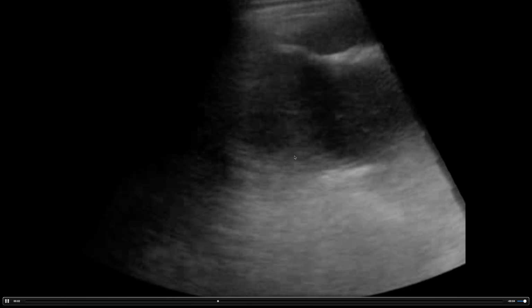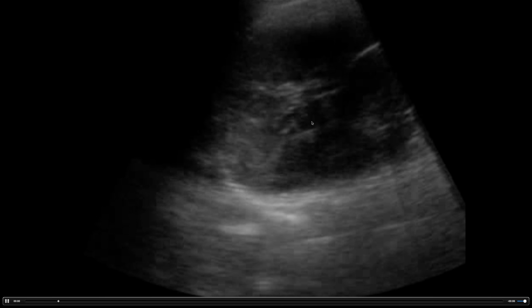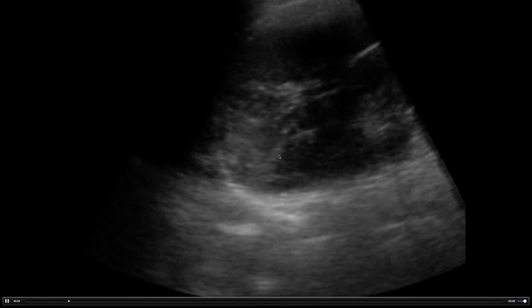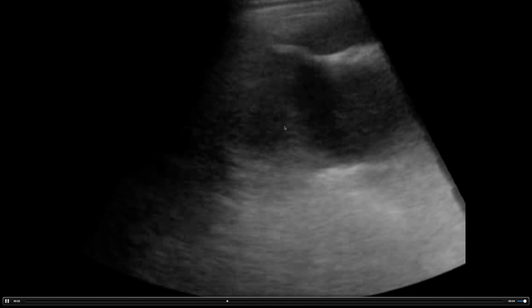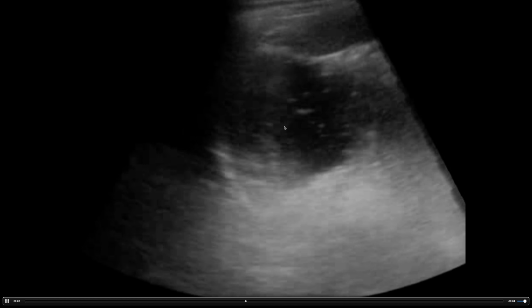The contours are not sharp. Here you go, right here. It almost looks like a cyst, sitting right in this corner crevice of the kidney and the spleen. As you fan through, this is actually your stomach with some stomach content. So just be aware that if you're seeing something that's suspicious, notice its shape and regularity, and if it's circular and smooth, think about where it is on the body. In this case, this is a normal stomach, or probably a stomach with a little dilation to it.